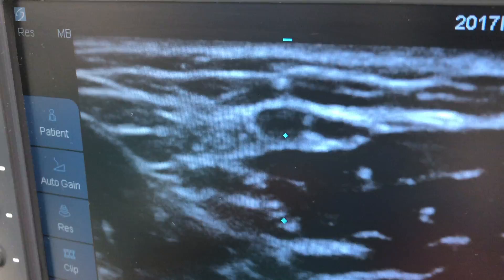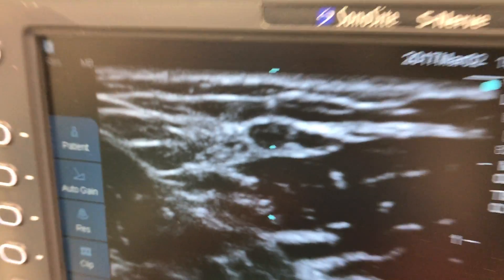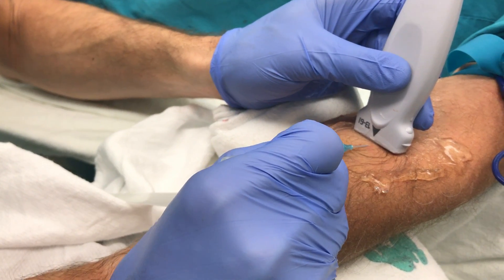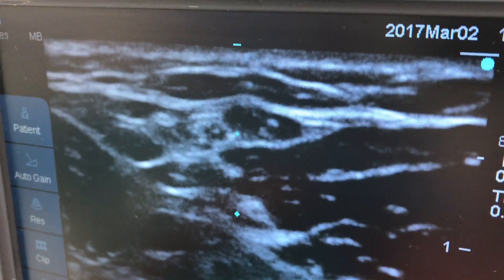I'm scanning back until I see the tip of the needle, which you can see just there. There it is — and now it's gone. So I know that's the tip. I'm going to follow that, looking at the screen, and advance from the tip.